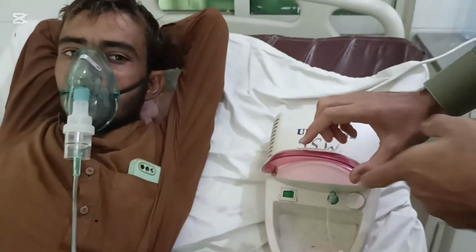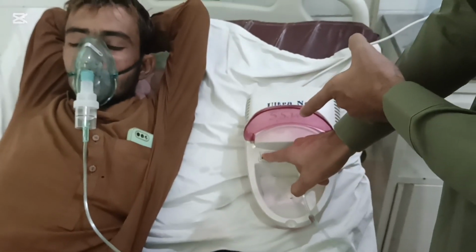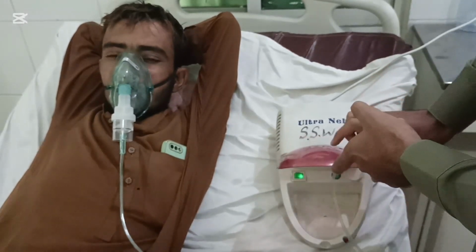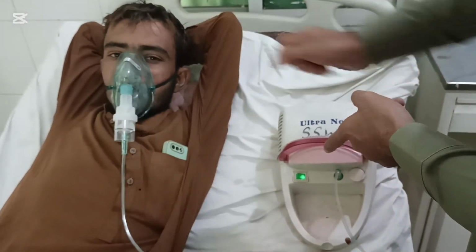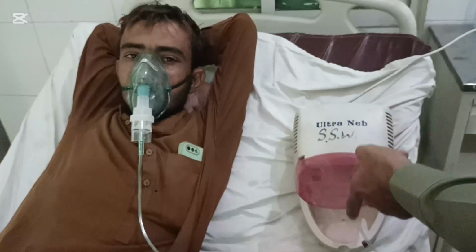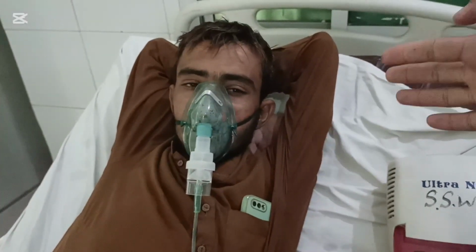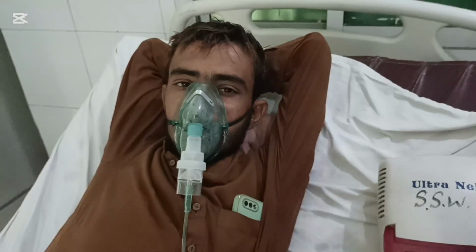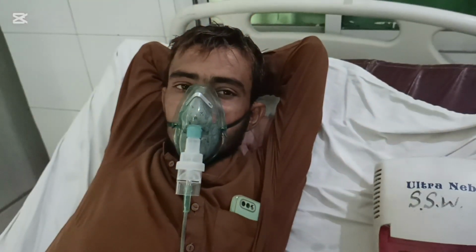Now start the machine by the on/off button. Now the machine is starting and the patient is getting nebulized. So for how much time should the patient be nebulized? For about 5 to 20 minutes the patient should be nebulized. So this was all about nebulizing the patient.